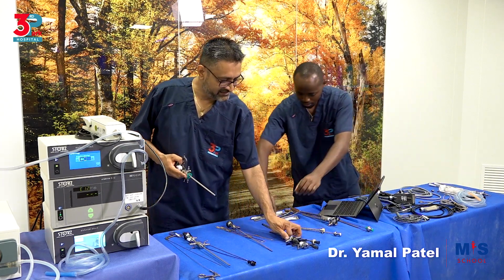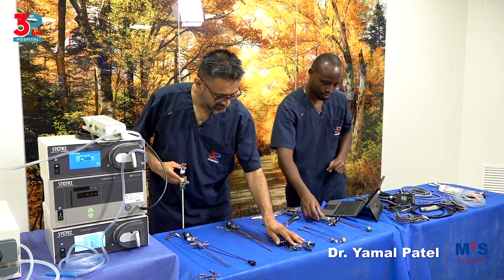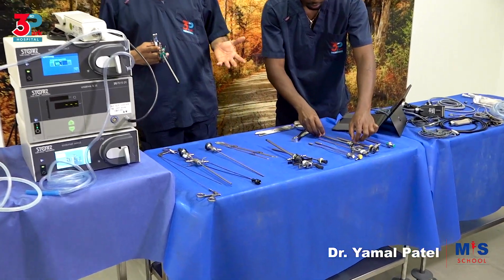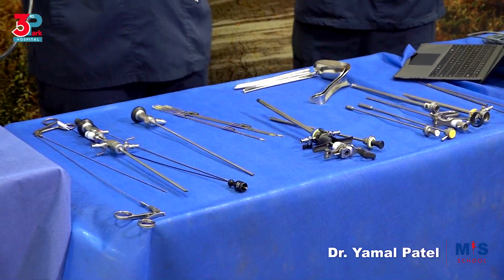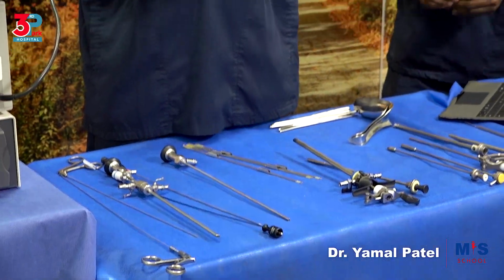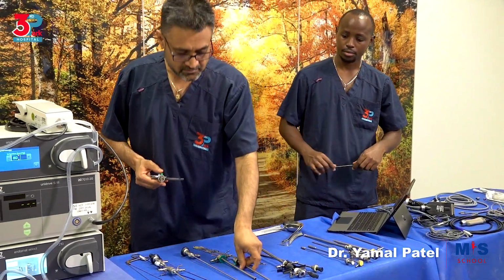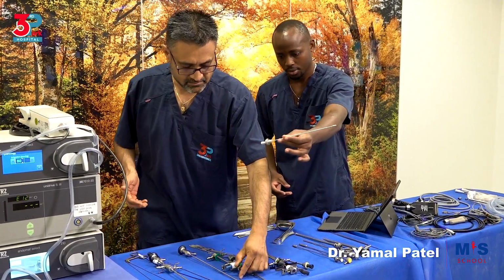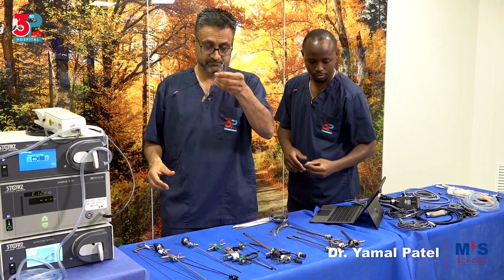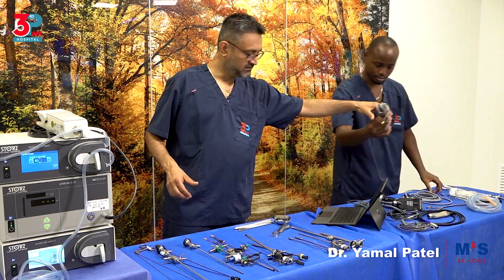So we have the resectoscope. One is in my hand. We have a second resectoscope here, which is from Olympus. We have a third resectoscope here, which is from Karl Storz, and we have different options. The resectoscope consists of, so I'm going to break this up, an outer sheath, an inner sheath, a working element, an obturator, and electrodes. Along with the electrodes come the cables.